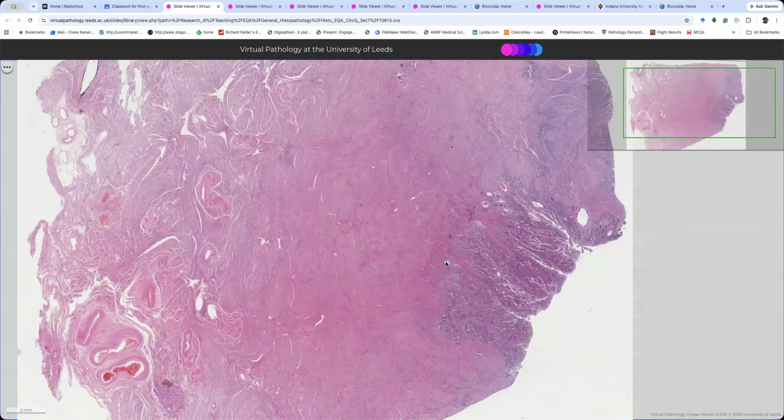Right, here we go. We're going to go from here to here, so it's this much. But this much is the same amount, okay? So in this case, you can't do this minus because you know it's invasive, and so you just have to do your best guess. And to be honest, the difference between calling this 20 millimeters with 1 millimeter of invasion and 20 millimeters with half a millimeter of invasion is not going to make any difference. All right. So don't get too hung up about exact, just accept that it is less than 10% invasion.